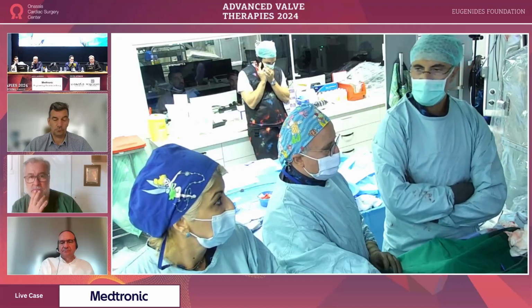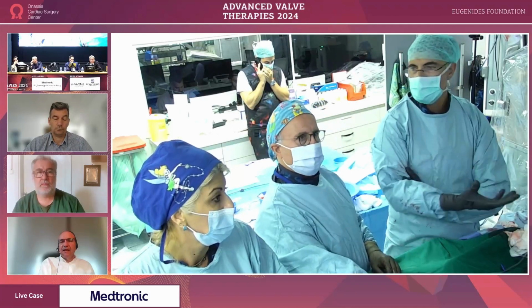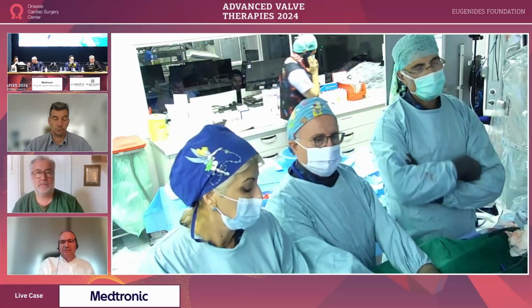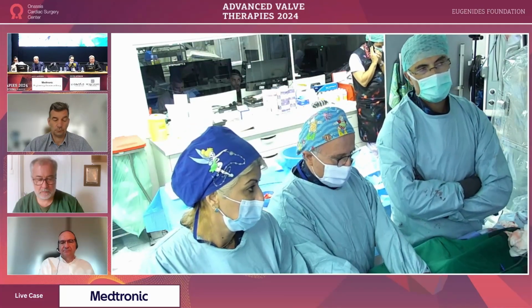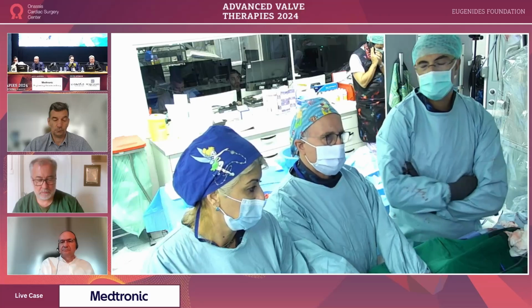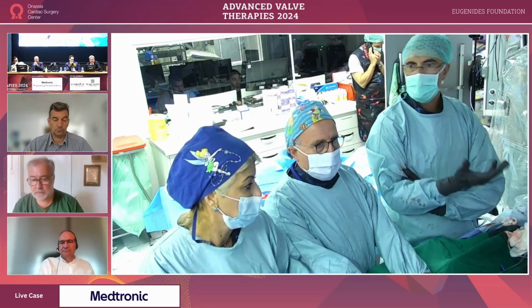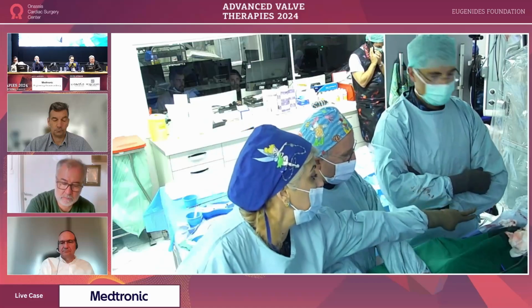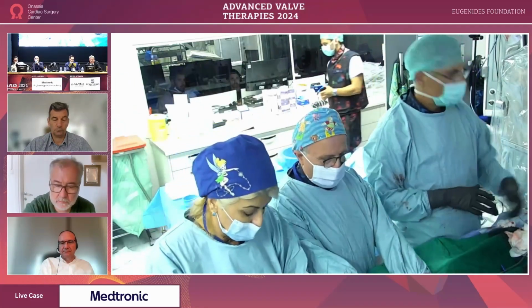I agree, because the valve is unstable. Most of the times it's fibrotic tissue that gives you this kind of headache. But yes, that's the big advantage with this valve. It's recapturable, it's repositionable. You can place the valve in the designated place.